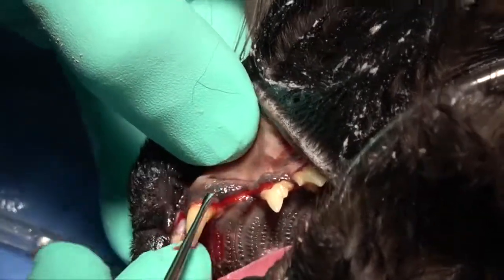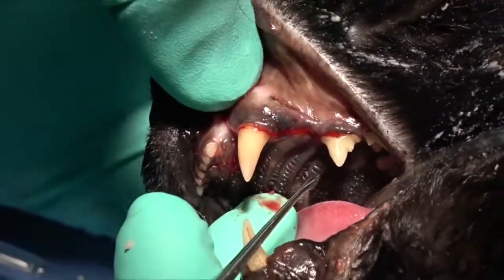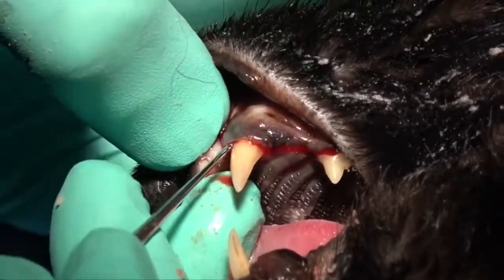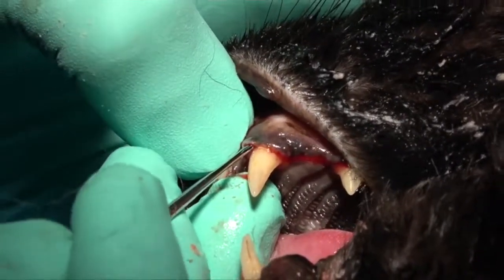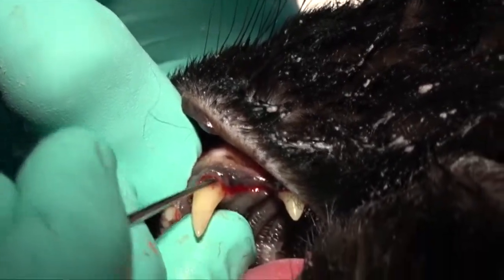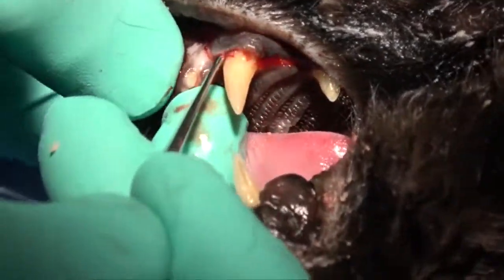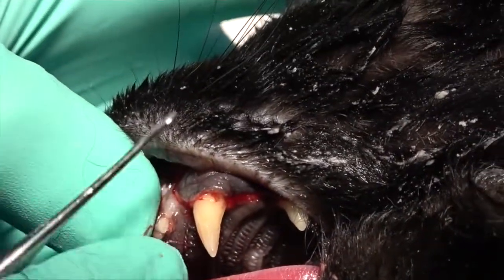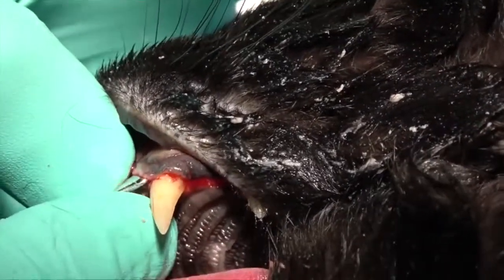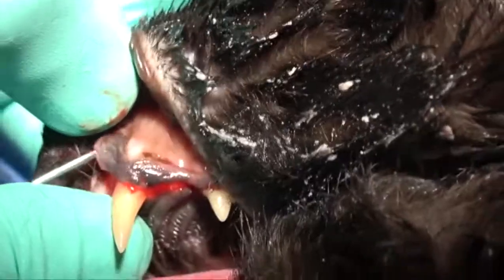We're making some progress there. We're going to go back and work a little bit more around that canine tooth. The corners can be particularly difficult, so you want to make sure that you work slowly and deliberately on the corners. Once you get a reasonable amount of mobility, you can get a little bit more aggressive. You don't want to get aggressive early, because then you have the potential to put too much pressure in one area and tear the gingiva.